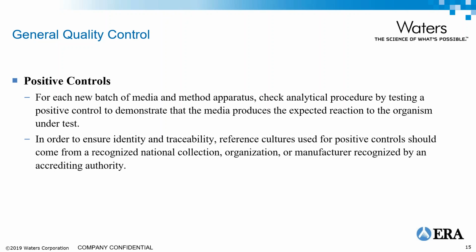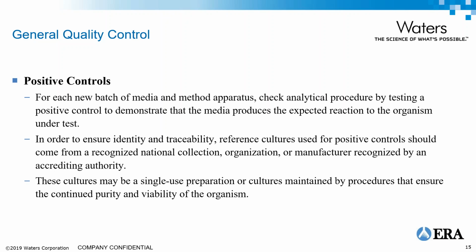The other thing related to the positive controls is they could be single use or they could be cultures that are maintained within your laboratory. But if you do that, you want to make sure that you're doing everything to maintain the purity and the viability of the organism if you're doing passages. You don't want to use the same culture that you've been freezing and thawing, and you potentially could run into issues with the organism actually changing. So often you will want to limit how many times you can pass it.